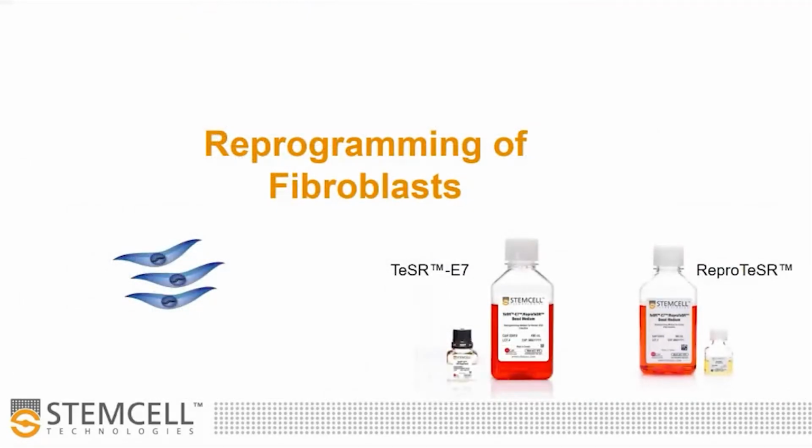So I'm going to speak now about the reprogramming of fibroblasts. And what you see on this slide are our two reprogramming media, so TeSR-E7 and ReproTeSR. So why do we have two reprogramming media? Well, it's actually a question of history. TeSR-E7 was our first reprogramming media, and it was based on the publication, the Essential 8 publication from Guokai Chen and James Thomson. And it's basically TeSR-E8 without TGF beta.